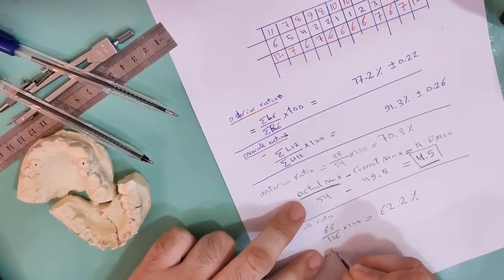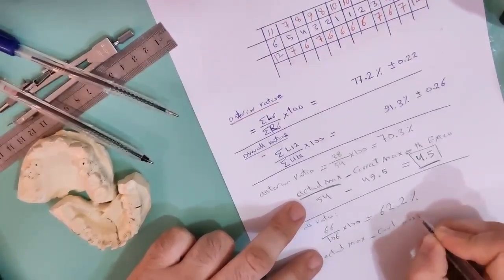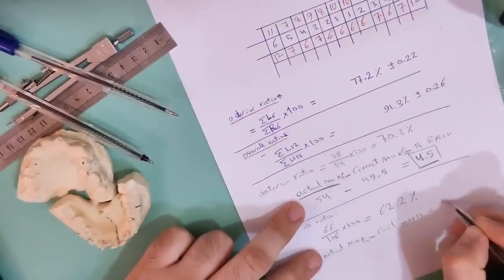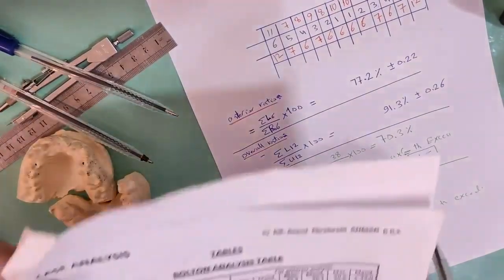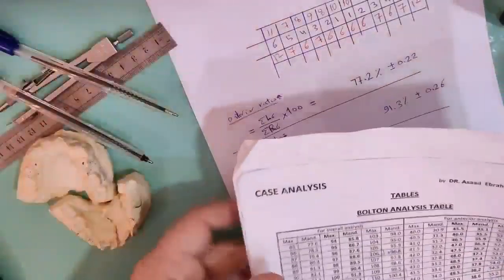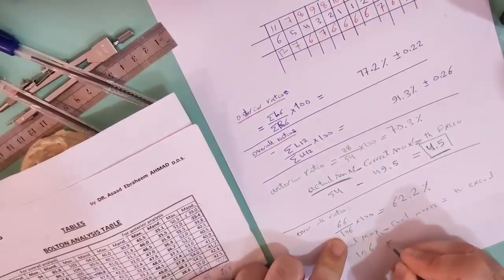Actual maxilla minus correct maxilla for the 12 teeth gives that excess number. As we did in the anterior ratio, we are looking for the maxillary value. Here, the actual maxillary is 106.